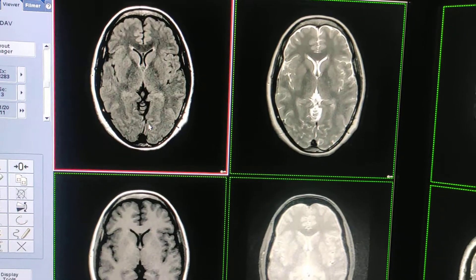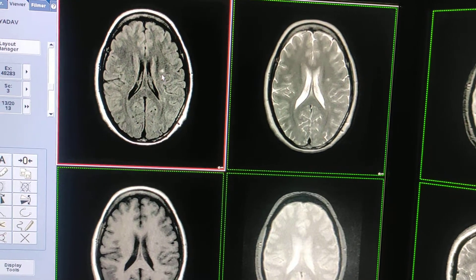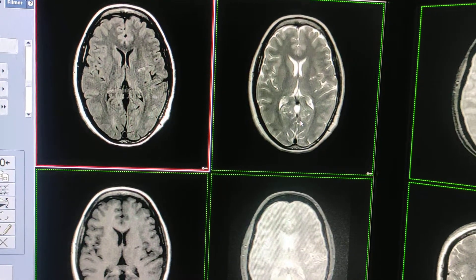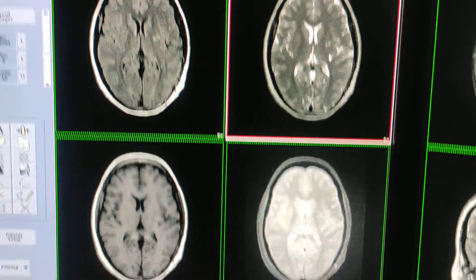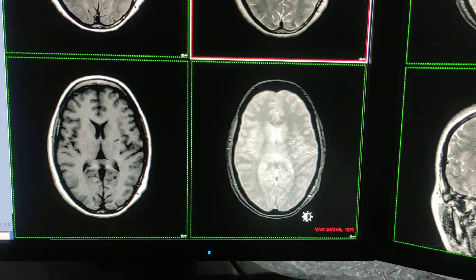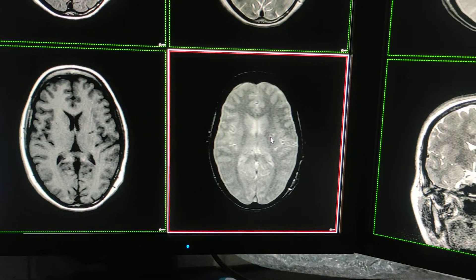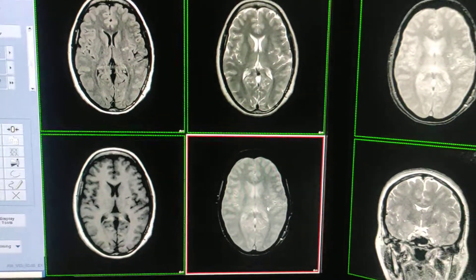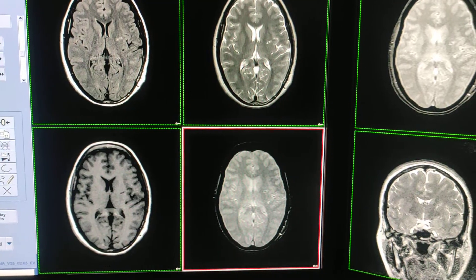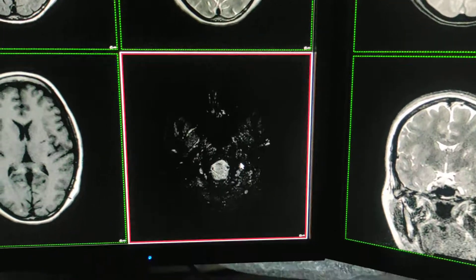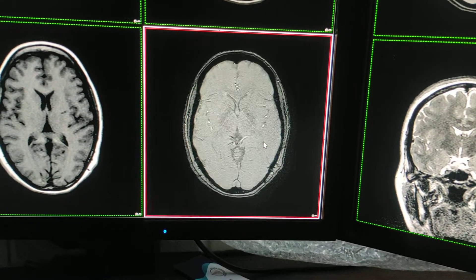Here in the FLAIR sequence, there is a tiny lesion you can see, surrounded by minimal edema. In the T2 also, a tiny spot surrounded by edema. T1 is hypointense. Now in the routine gradient sequence, here is a tiny calcification seen. To confirm whether it is a calcification or a vessel, I have taken the SWAN sequence to rule out the calcification — it's a calcified granuloma.